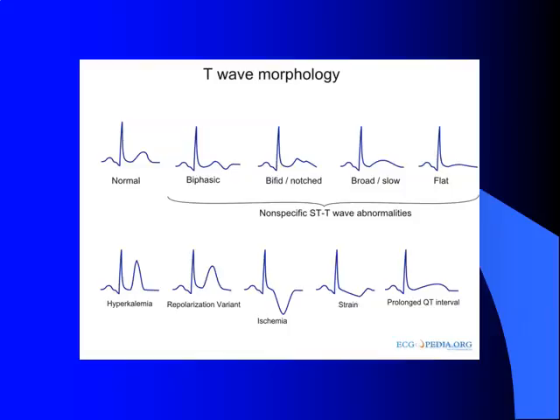So just know there is a lot of different T waves. They can all mean different things. We'll get into some of those in a little bit more detail on the next lecture.